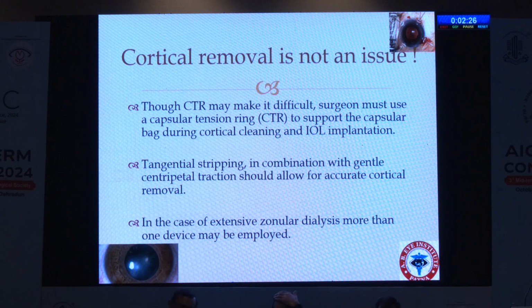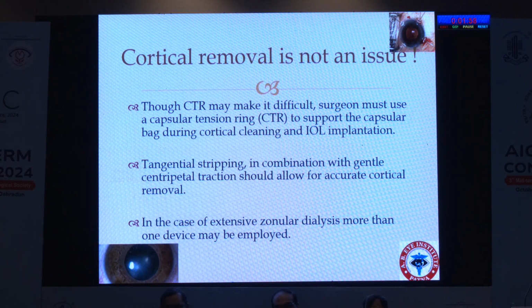So, though the CTR may make it difficult, the surgeon must use a capsular tension ring to support the capsular bag during cortical cleaning and IOL implantation. Once you see the capsule is contracting and you still have some zonules and some cortex remaining, it may be a good idea to put in the CTR, especially in patients who have pseudoexfoliation. In those who do not have pseudoexfoliation, you can put the CTR later also. But when stripping the cortex in patients with pseudoexfoliation, it's a good idea to put the CTR even before removing the cortex. Otherwise, you may pull the whole bag together because the zonules are weak.